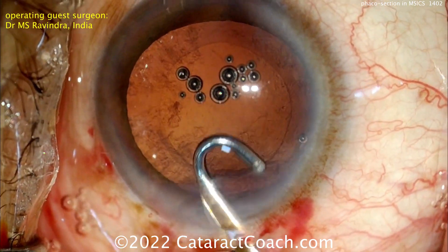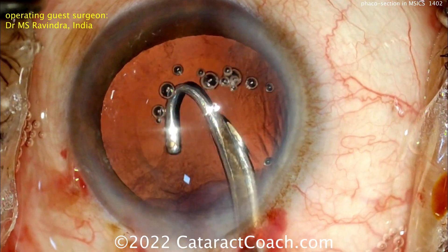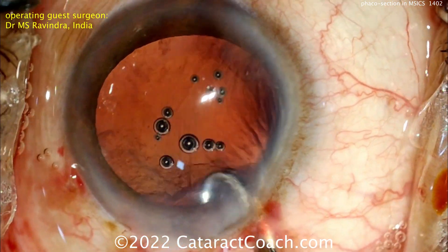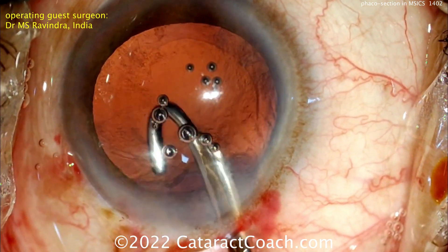Other options: if you have a FACO machine available, bimanual IA may give you a better approach to get everything out. But with just a little bit of patience, it's nice to see that even with simplified instrumentation, you can have a really beautiful result.